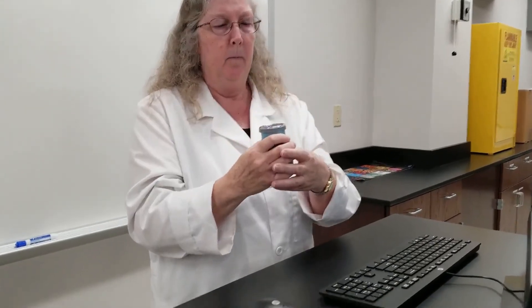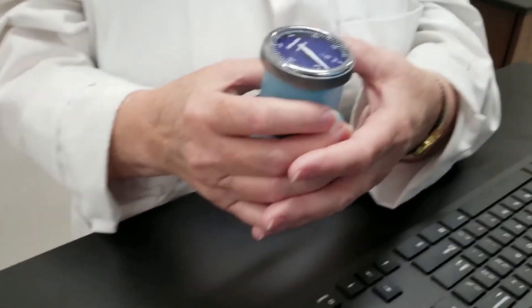This will be the IRV, the inspiratory reserve volume. I'm going to be breathing deeply, take a deep breath, but then exhale normally without forcing it out. The number is about 500.